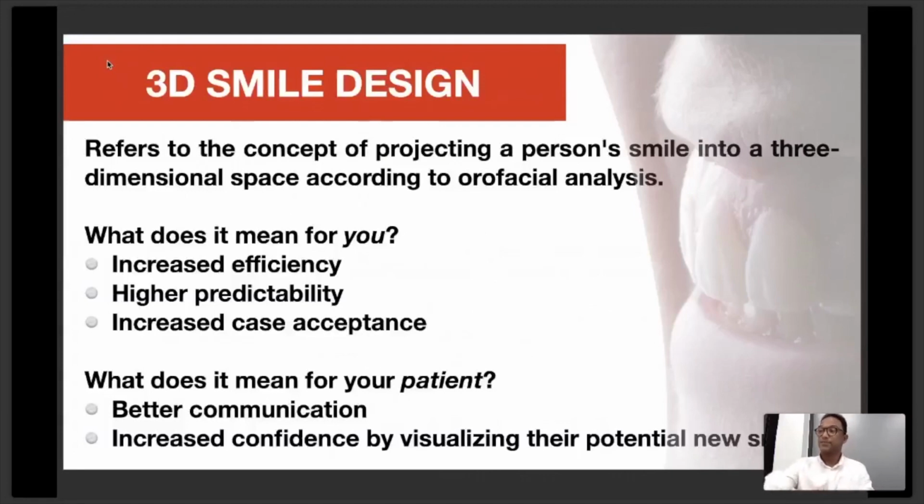It means that you can get increased efficiency, you can get a higher predictability of the final outcome, and of course, you can get increased case acceptance.